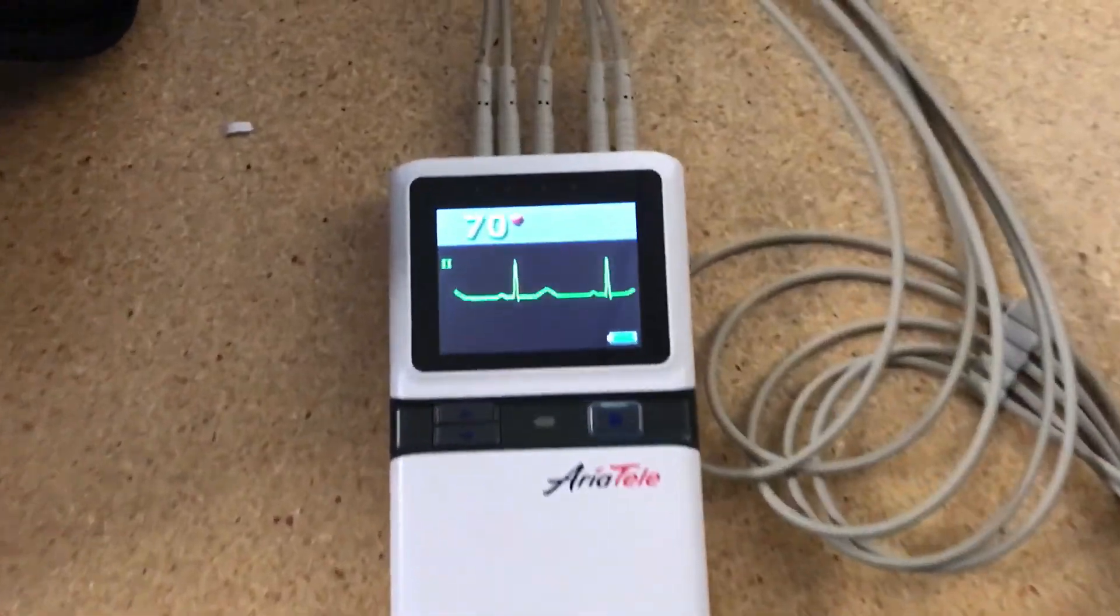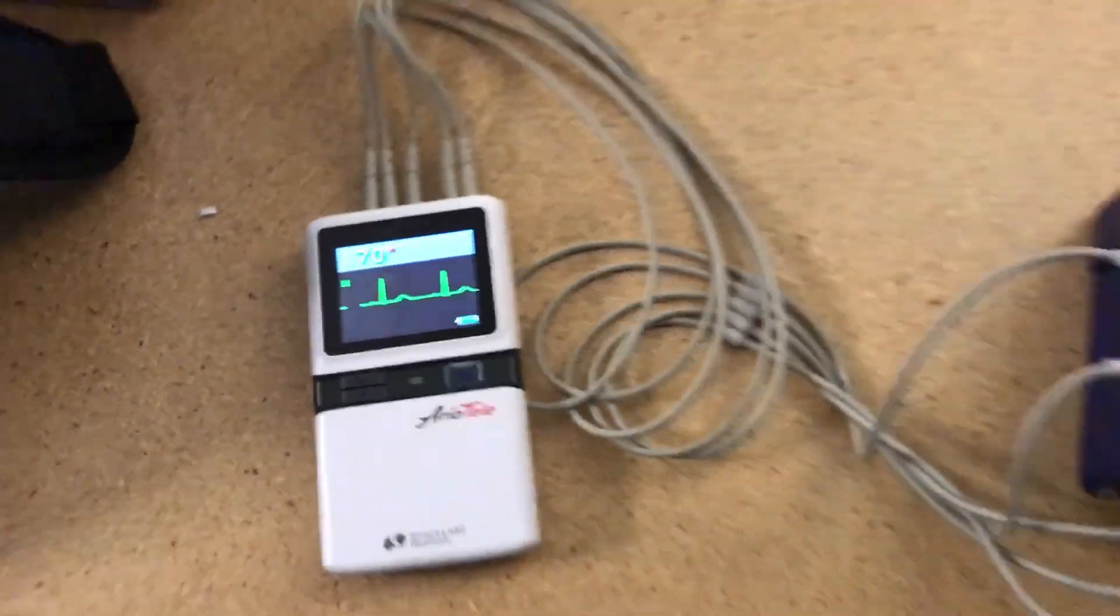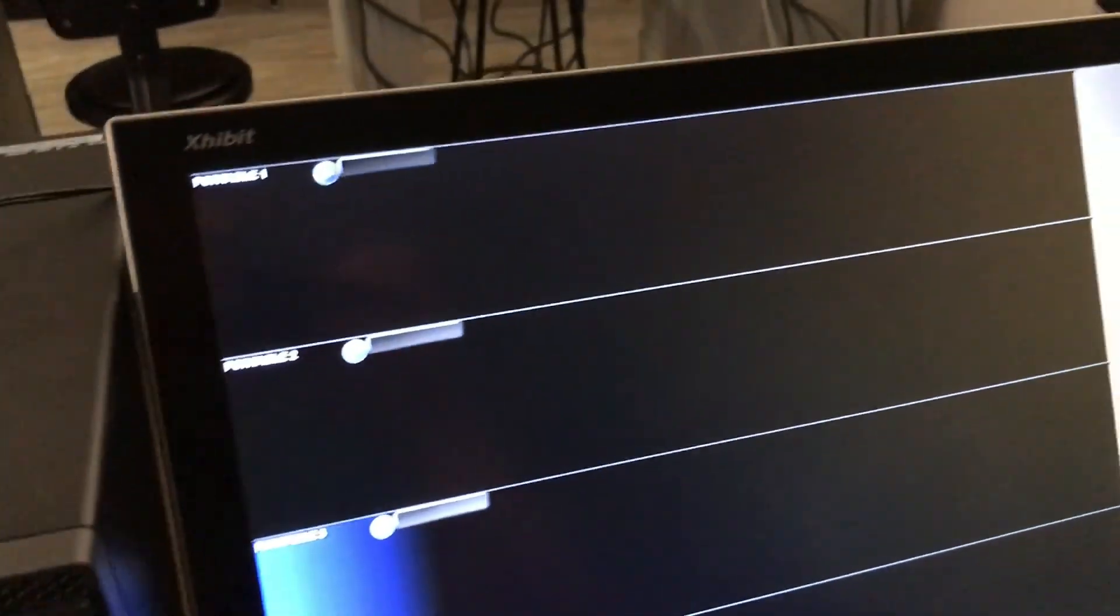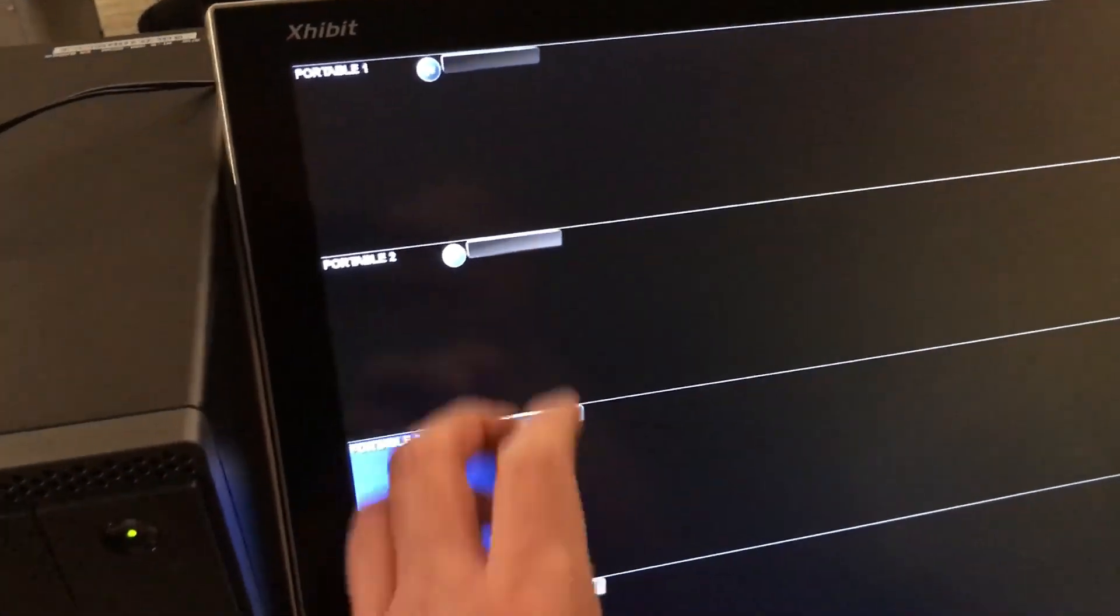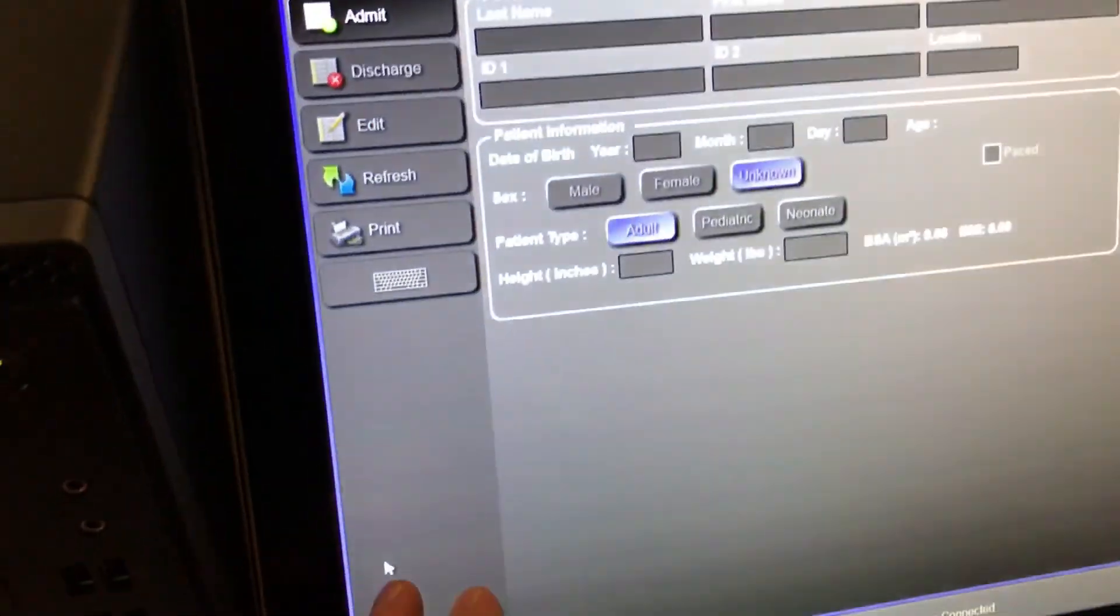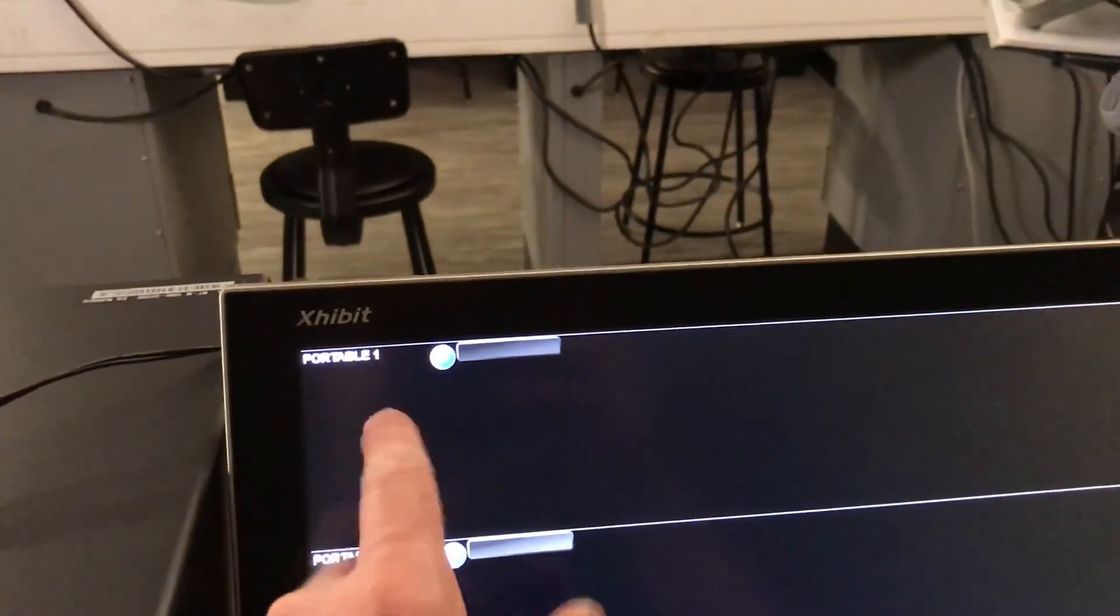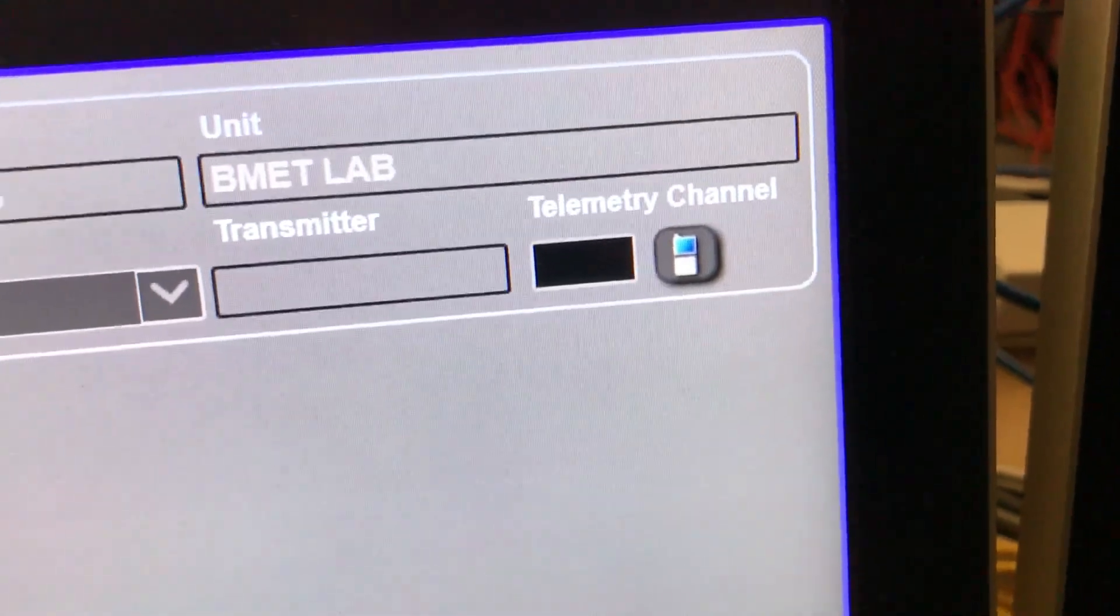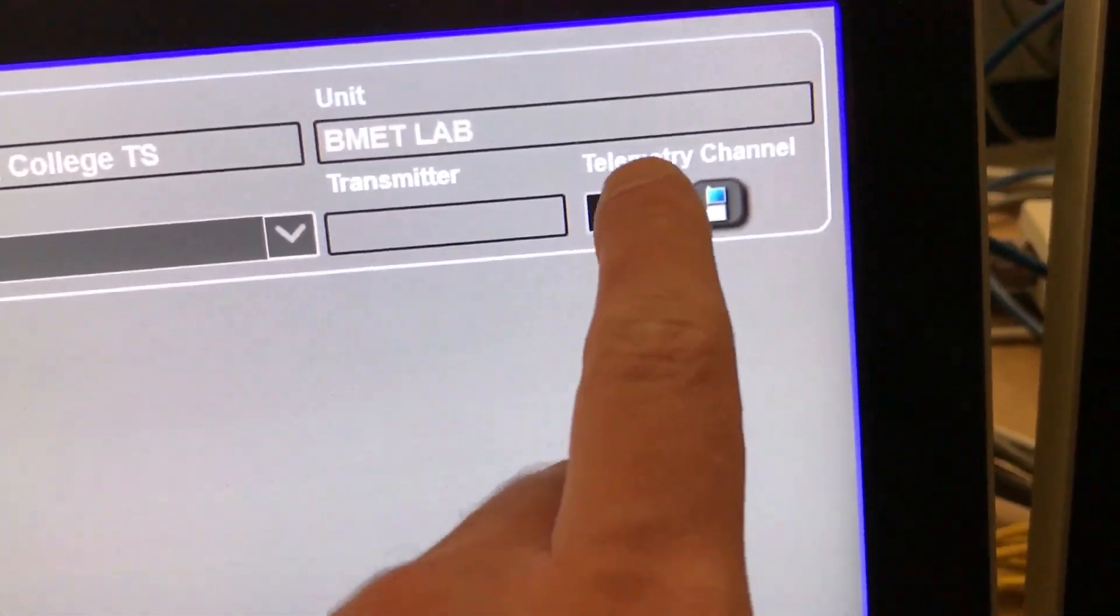Alright, so now that the transmitter is transmitting, we can come over here to the central station and program in or tune in the portable unit to the central station so we can see the trend information. So I'm going to just select any of the portable beds over here. I'm just going to select the portable number one. Over here at the corner, you have the telemetry channel entry button or the field over here.